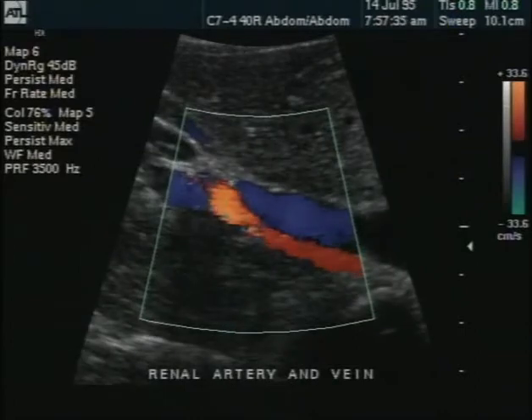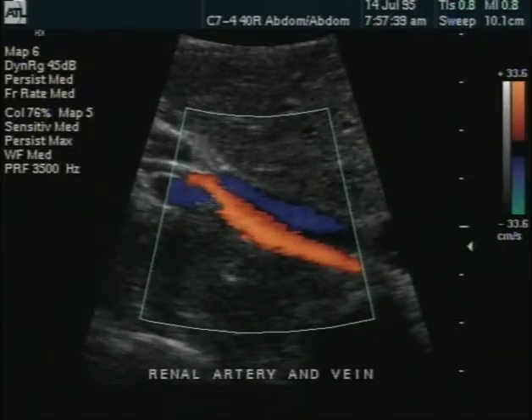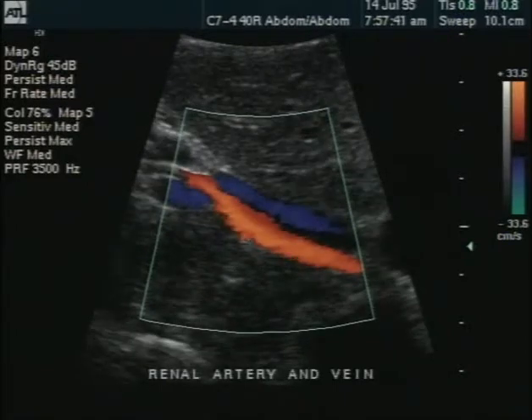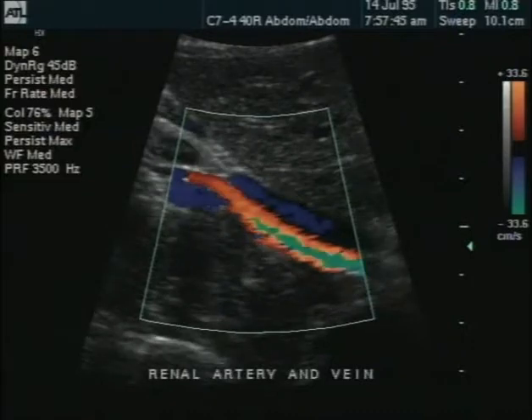Now that we're familiar with the anatomy of the visceral vascular system, let's discuss the ultrasonographic appearance of the abdominal vessels. First, we'll talk about the on-screen appearance of the normal abdominal arteries and veins. Abdominal veins, like veins in the peripheral system, are most often located alongside a corresponding artery. The arteries can be used as landmarks for locating the veins.